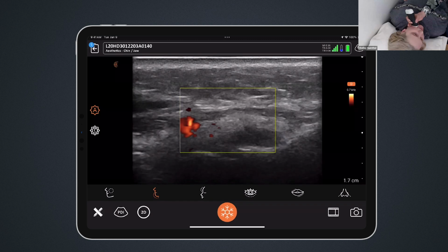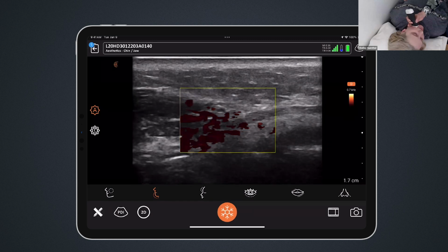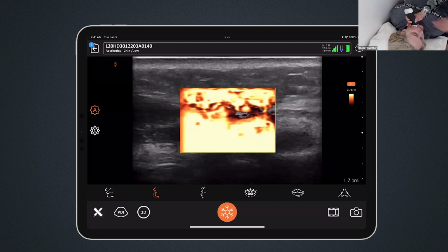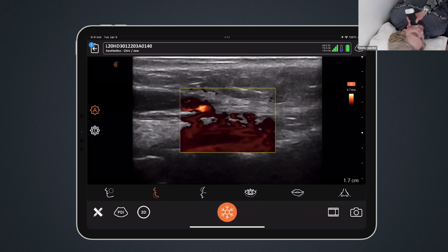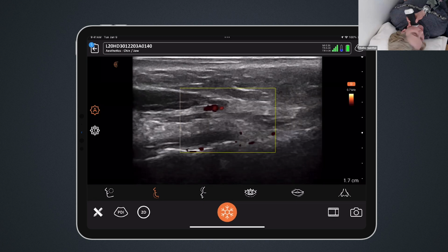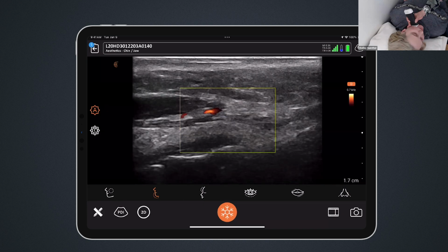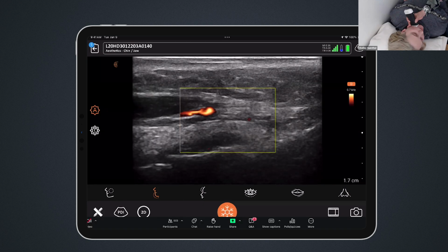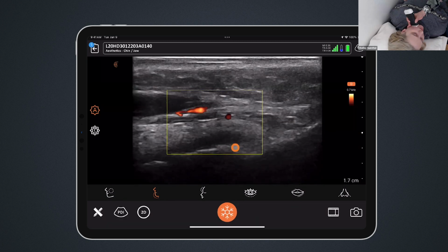Yeah, no kidding, no pressure. I think I saw it there. I need a better grip on my, like Dr. Weiner was saying, you kind of have to anchor your finger. There's at least part of it right there. Yeah, part of it there. It's a little bit tortuous. There we go. That's it. Okay, excellent.